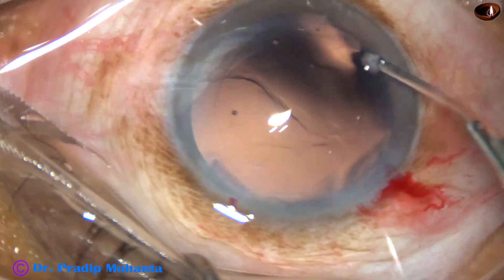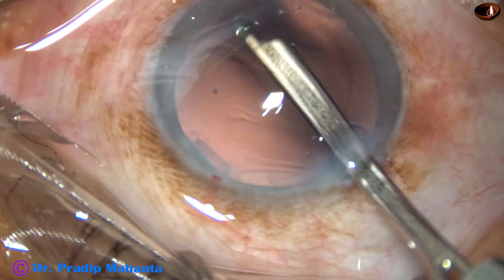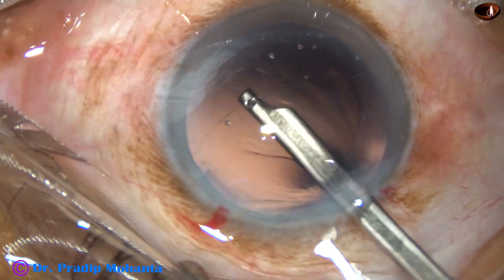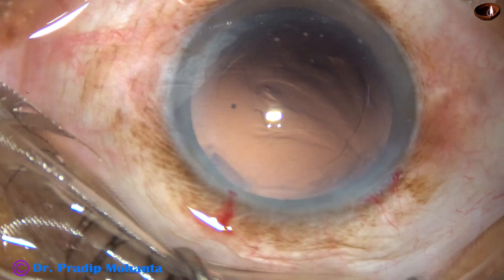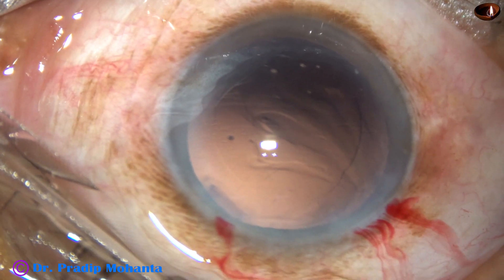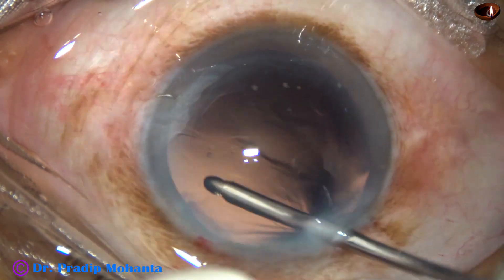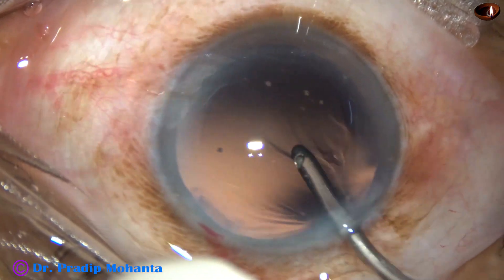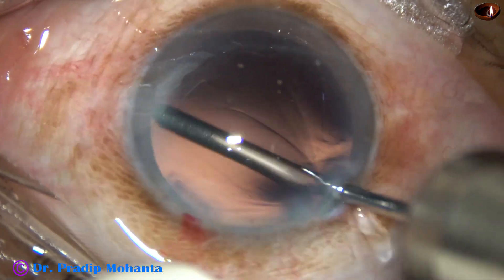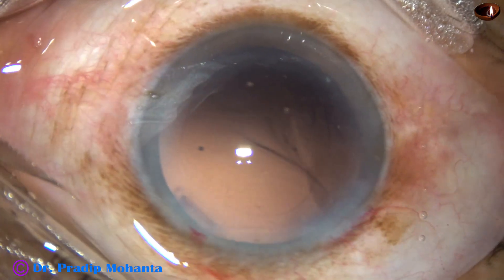The posterior capsule appears clean, but some cells are still sticking to the posterior capsule. So I am going to direct the irrigating jet of fluid towards the posterior capsule, and by sweeping movements the cells are dislodged. We can call it hydro polish.